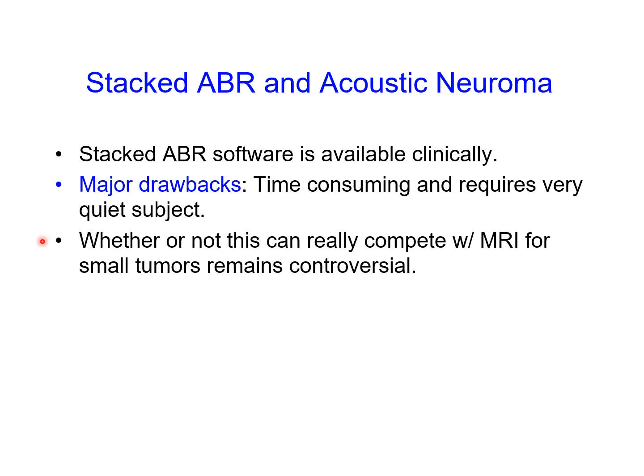The last point is whether stacked ABR can compete with MRI to detect small tumors really is a debate. So I would say if I were the physician, I would go with MRI, which is more precise. However, for audiologists, you do need to understand that stacked ABR can be used to help us identify tumors.